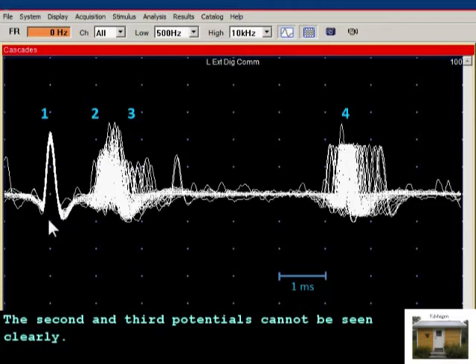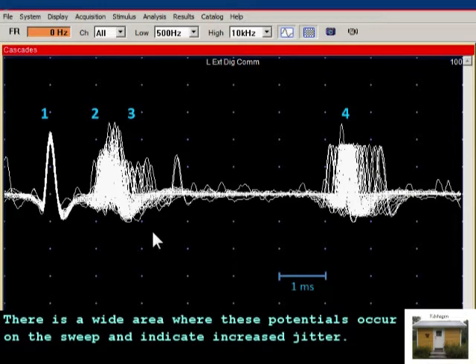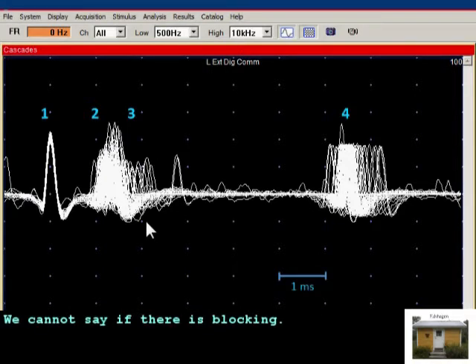The second and third potentials cannot be seen clearly. There is a wide area where these potentials occur on the sweep and indicate increased jitter. We cannot say if there is blocking.